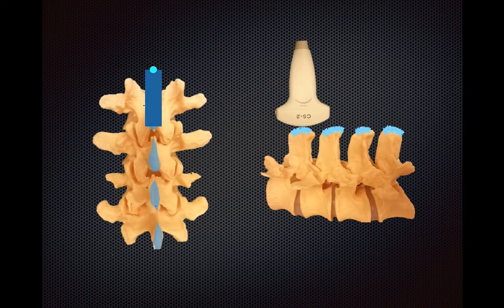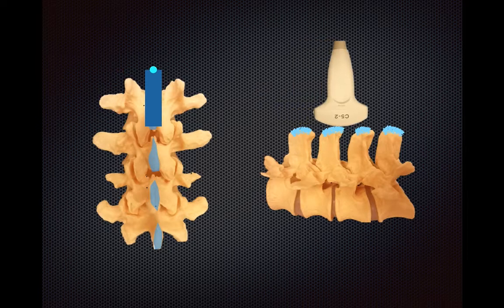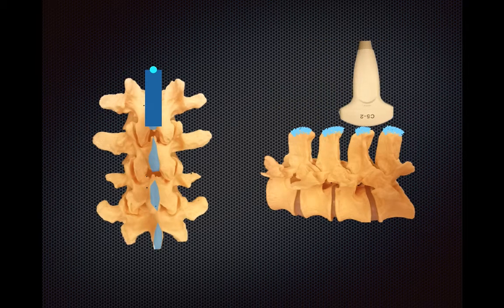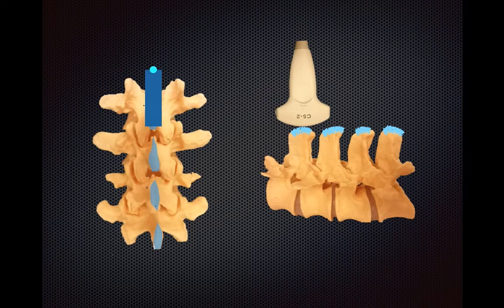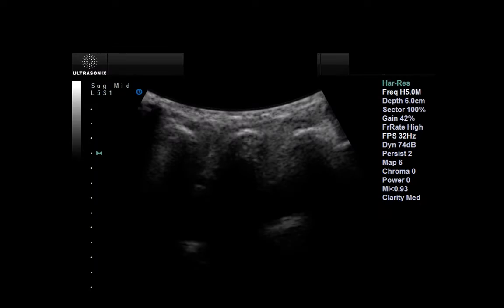What you're going to do is image the spine in two planes. Here I'll start out longitudinally, but you can easily start out transversely as well. What you want to do is identify the midline of the spine, and in particular the spinous processes. What you might see on ultrasound is an image that looks like this. At the very top would be the skin layer, and then the hyperechoic elements here would be the sacrum, because it looks distinctly different from the spinous processes of L5, L4, and then L3.